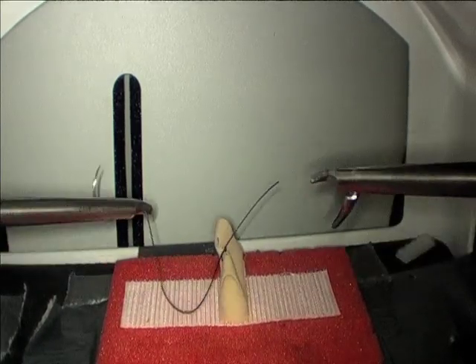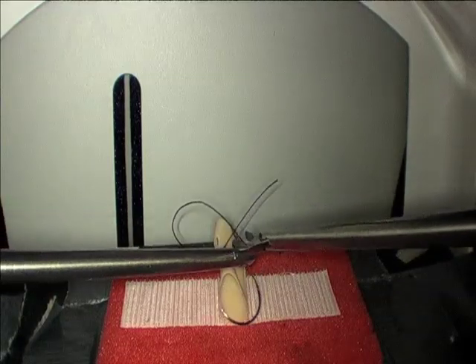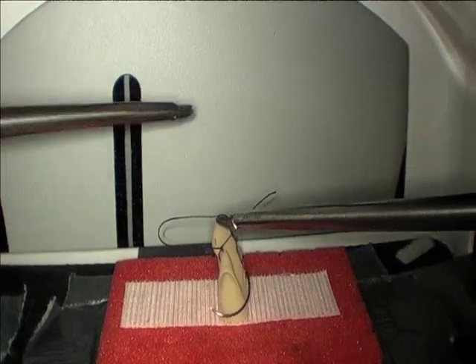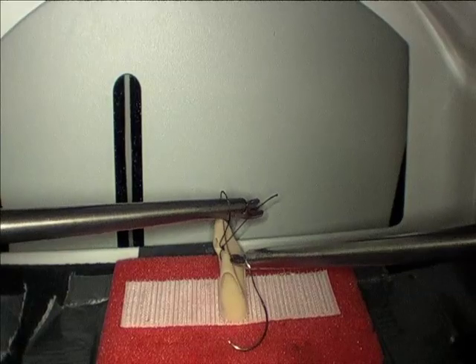Flip the suture over again, grab it in your right hand such that the suture is coming out of the tip of your needle driver. Set up your loop, come over the loop, grab your tail, and pull it through.